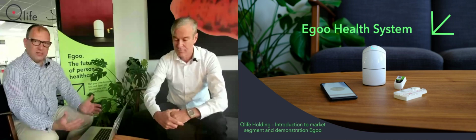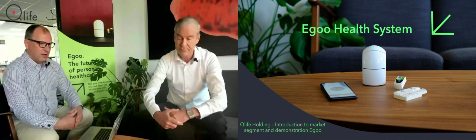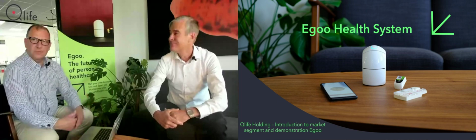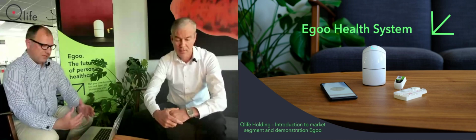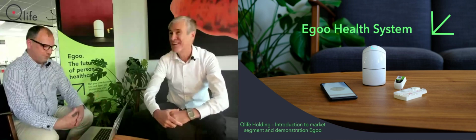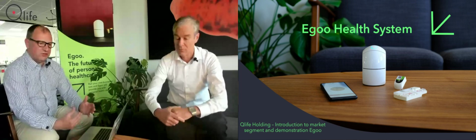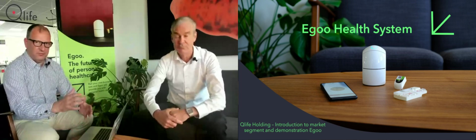Today, we are on site at Qlife to make a live demonstration of the system, and we would like to test for one of the assets as well, CRP. With me today, I have the CEO, Thomas Wartho. Hello. Welcome, Thomas. Thank you, Carl. And please have some patience in relation to questions because we're going to do a live performance.